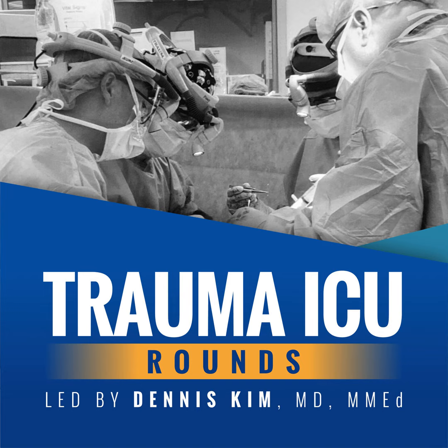Are they having excessive work of breathing? And when you look at the ventilator, what sort of minimal vent settings are they on? Typically our protocol here is an FiO2 of less than 40% or even better 30%, with minimal PEEP, anywhere from 5 to 8 centimeters of water, and then a quick glance at the ABG if available to ensure the absence of any significant or severe respiratory or metabolic abnormalities.